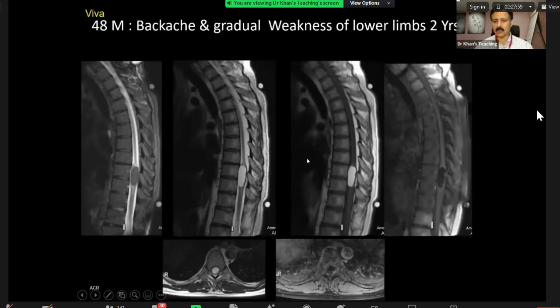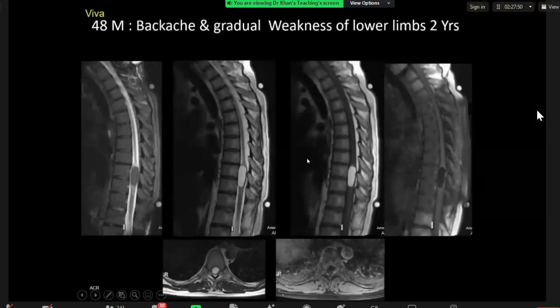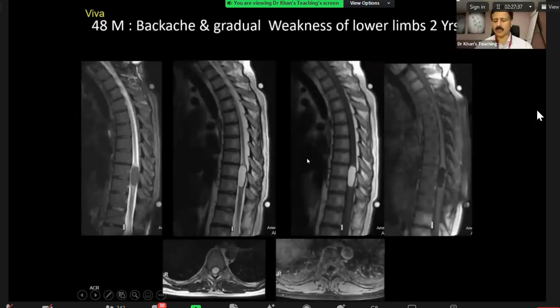Having said that, how do you discriminate, radiologically speaking, between a lipoma and a dermoid? And this is a key question for the Viva. I think this would be an extremely atypical. Where I've heard about it is lipoma of the filum terminale, so it's at the end. Oppose that, please remember, if you read your Chapman, it tells you that lipomas can also be intramedullary, by the way.